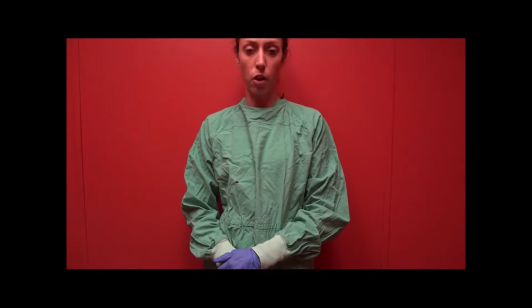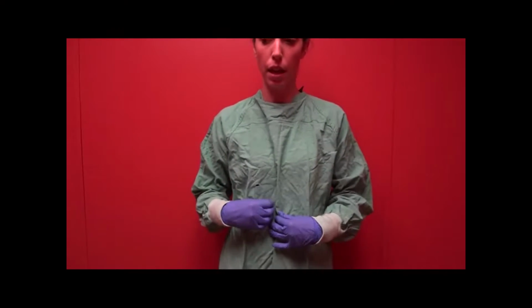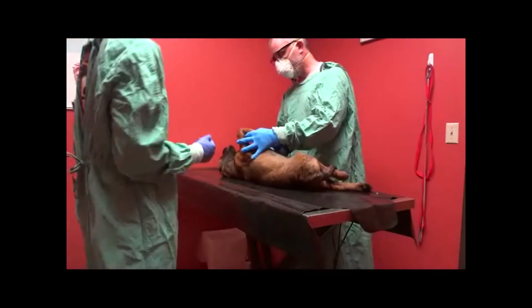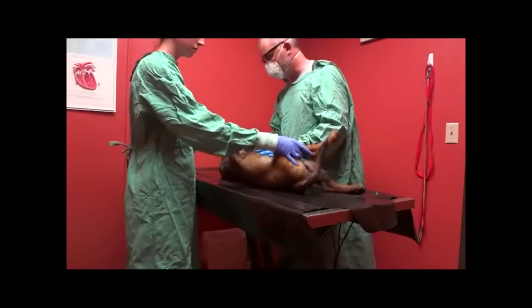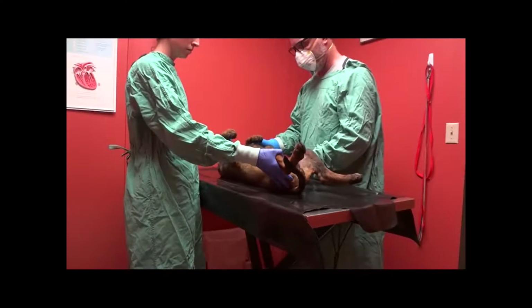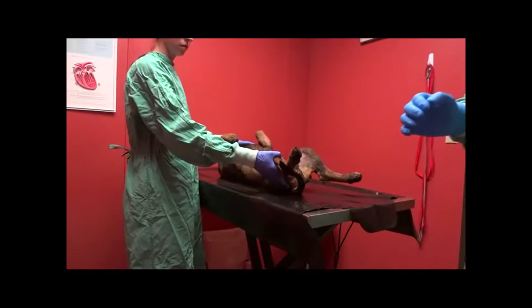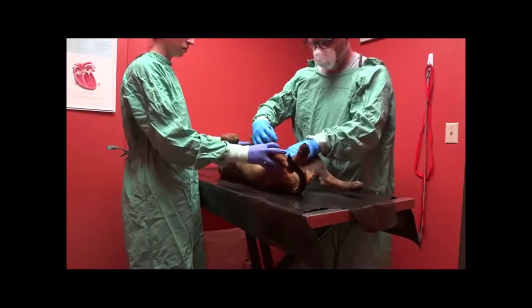Today we will be performing a necropsy on a canine, a 6-month-old puppy. We will need gloves, a gown, and our mask. This is Dr. Joe Worster, and we are performing a necropsy on an approximately 6-month-old male cadaver dog. So I'm about to make a midline incision, and we will do our abdominal exploratory and get some sections and biopsies for practice.